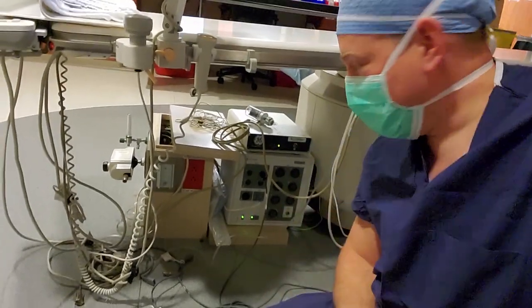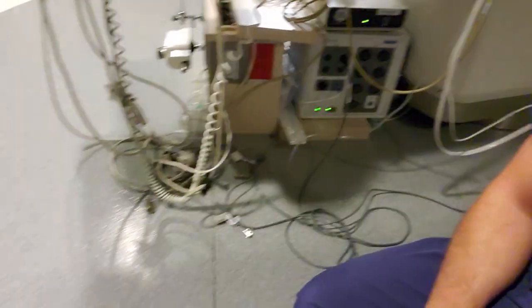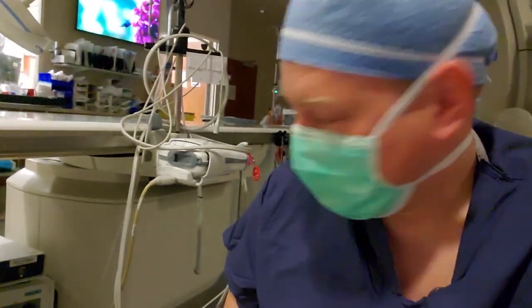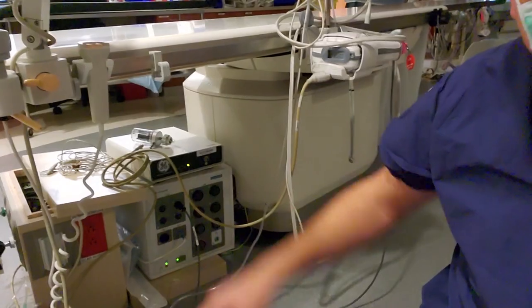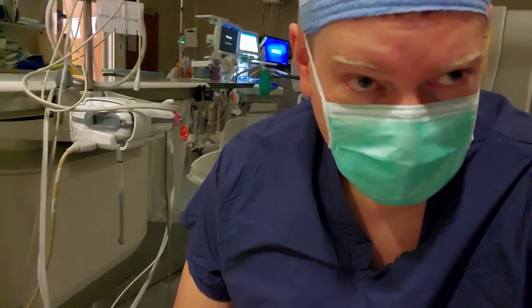You can tell this is a downed cath lab. And I have cables just strewn about the floor. See that? I got stuff thrown over there, just stuff all over back in here. And that just shows me that there is no real good storage solution for the cables. Now, what we're probably going to have to put in is some sort of hooks underneath here so that they can wind the cables up and stow them correctly. But right now, you can see they're just kind of thrown on the floor. They're pulling on each other, they're absolutely everywhere. So that's step one, proper cable storage.